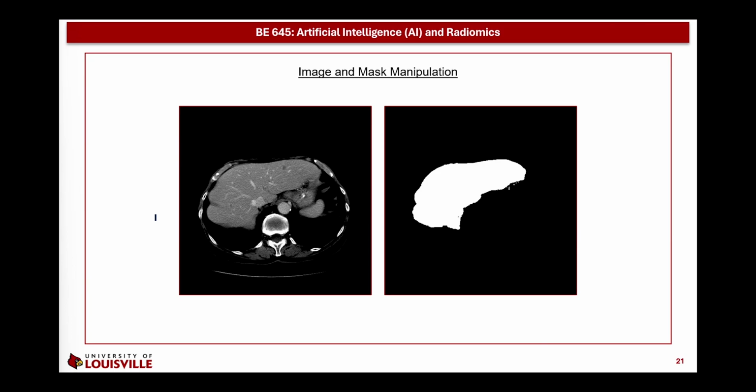For example, in this figure is a liver, it can also be kidney or lung, and then based on that ROI we need to extract the first order features, second order features, or any features that we need. Then based on these features we can apply them to a classifier to say that this image reflects a benign or tumor or reflect the grade of the tumor. It can also diagnose it can be benign or malignant based on that model.